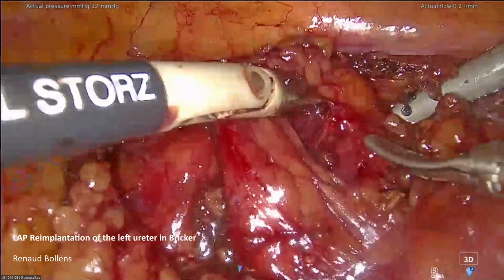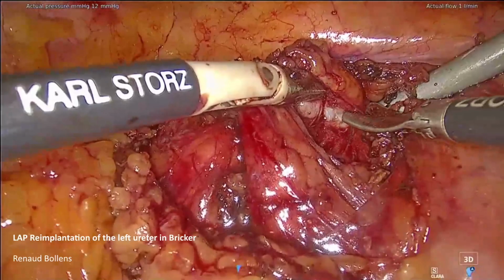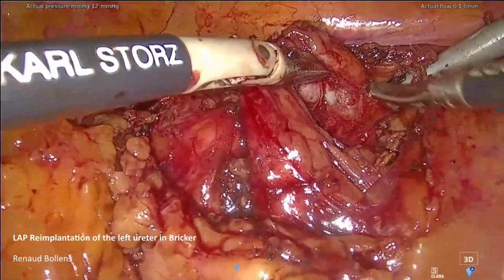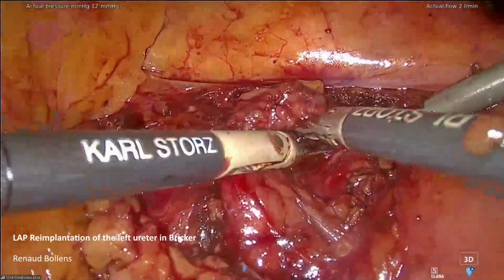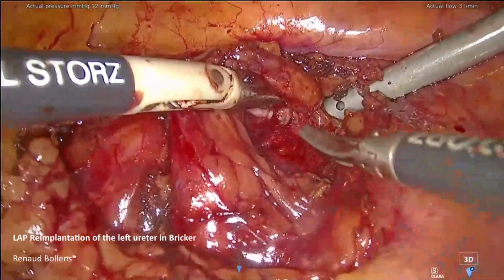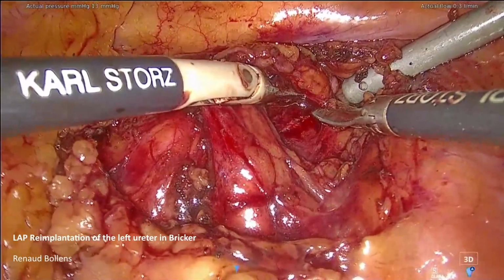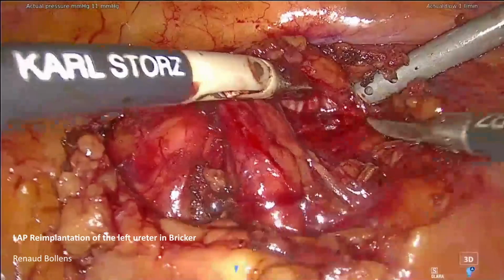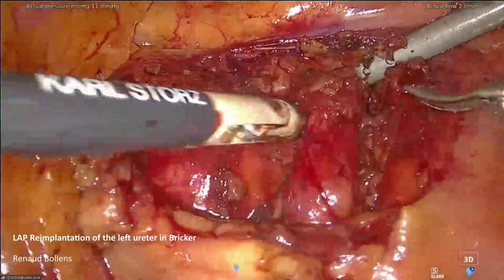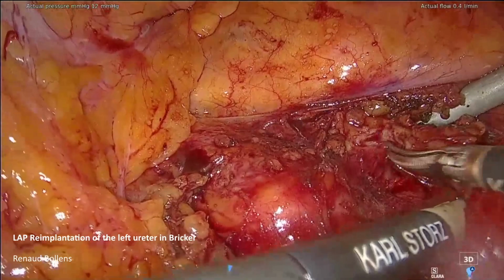And what do you think about the first surgical approach? I mean, does the choice of a minimally invasive surgery help you in performing a re-intervention, in comparison with an open approach? It's much better, because when we do a re-intervention, we descend the instrument inside. You imagine that if I have to put my hands, retractor, my head, and everything here, it's impossible to see what I see here. For me, it's clearly a big advantage in a redo surgery, because we don't need to mobilize so much tissue or dissect so extensively to have a vision and an access on the structure. That's my opinion.